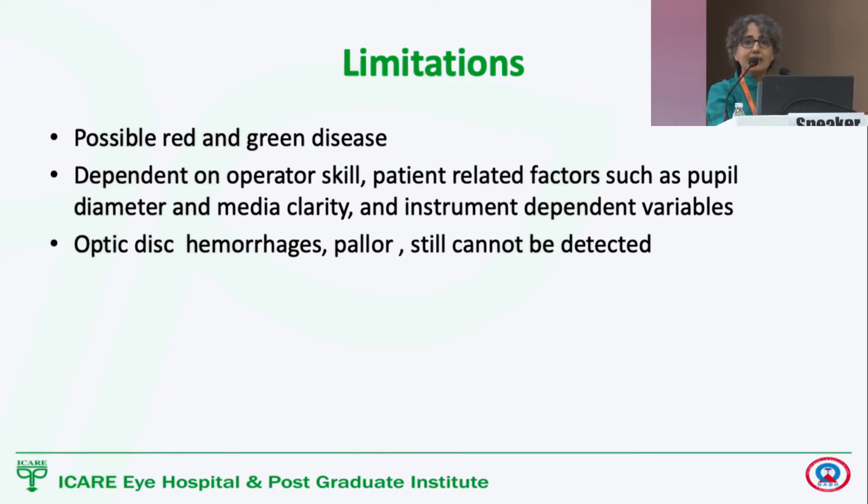So those are the things, like even in gonioscopy, you have imaging tools, but the magic of a lens being put onto the eye cannot be substituted by these machines. A clinical good examination of the optic nerve head cannot be substituted completely by the OCT. Thank you so much.